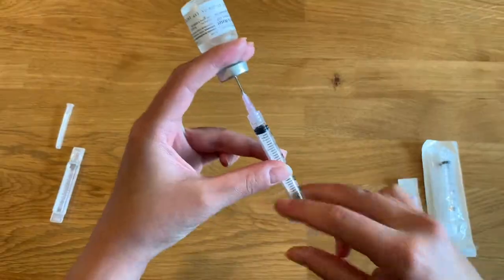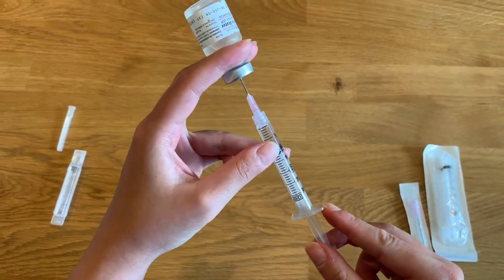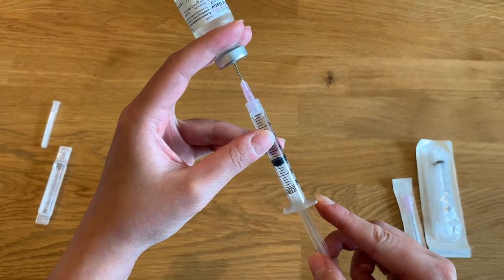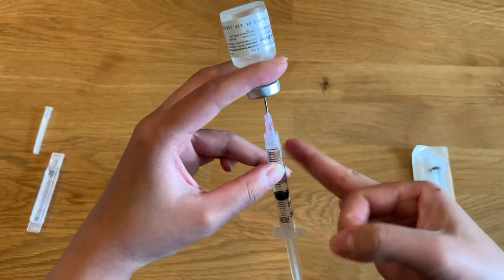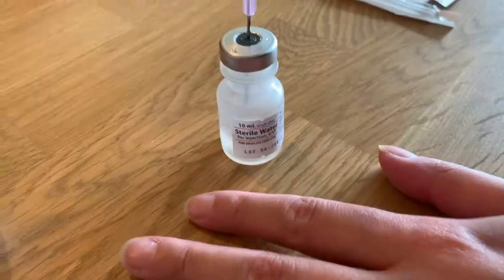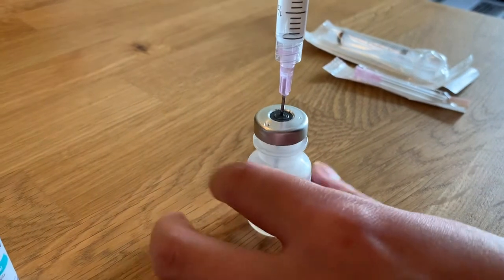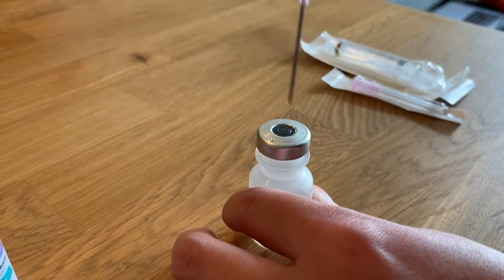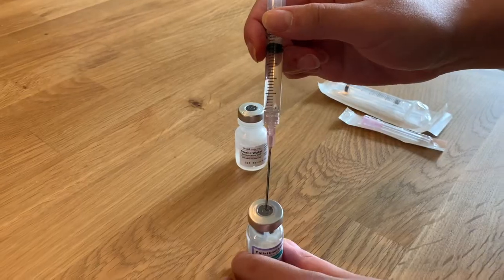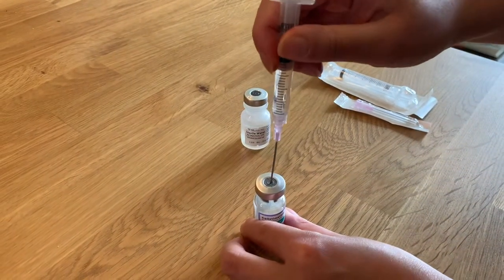Then draw up 2 milliliters of sterile water into your syringe. Make sure there are no air bubbles in the syringe and that the top of the plunger is even with the 2 milliliter mark on your 3 milliliter syringe. Put the vial back on the tabletop and remove the needle from the top of the vial.